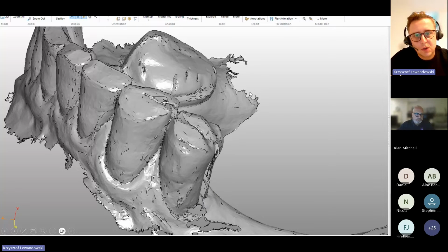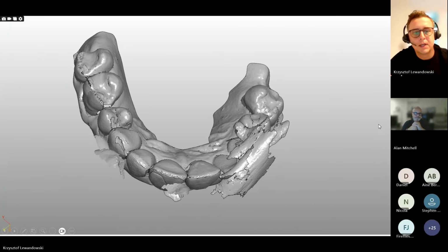The next slide shows an example of the double imaging on the STL record. That's the lower surgical arch, and we can see the double imaging on teeth 3.3 and 3.4. Another slide shows a maxillary case where we can see two problems.